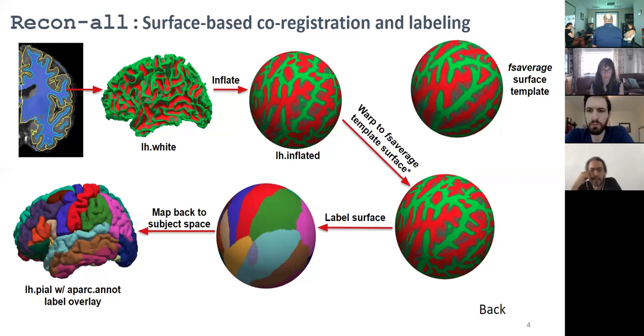Right, and it would be possible. I don't know if somebody has done this, but if it doesn't take a terrible amount of time, it would be possible to use a general cross-validation framework on top of this, get group-specific templates, and then compare them using cross-validation or something like that, and try to figure out what the differences are between those group-specific templates.